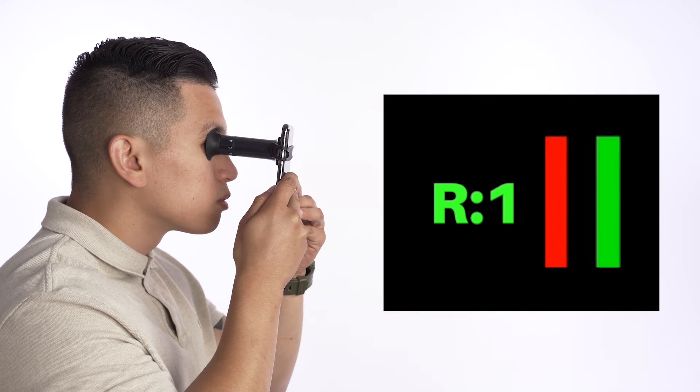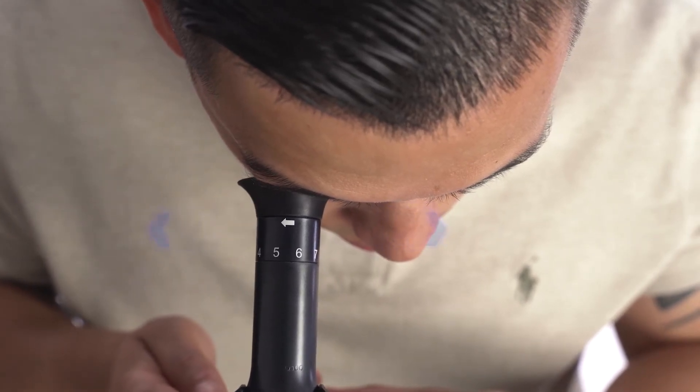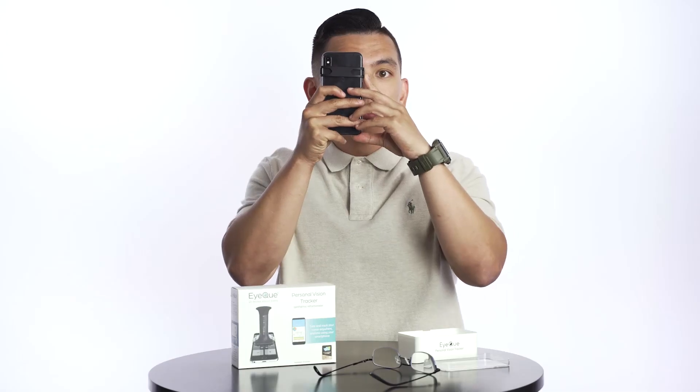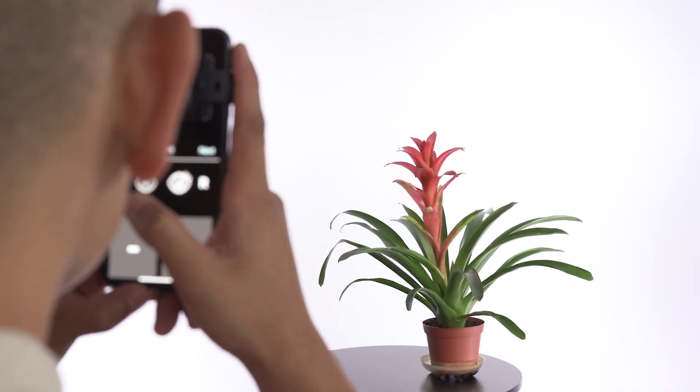You should also see a red and green line. If you're having trouble seeing the lines, try adjusting your phone from side to side until the lines come into view. Once you identify both lines, keep your non-testing eye open, relaxed, and focused on an object at least 6 feet away.